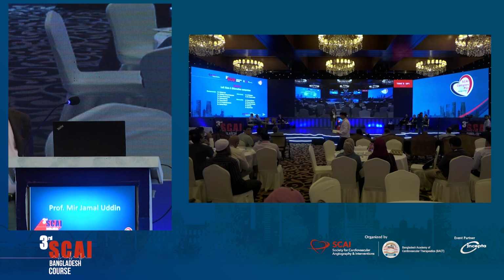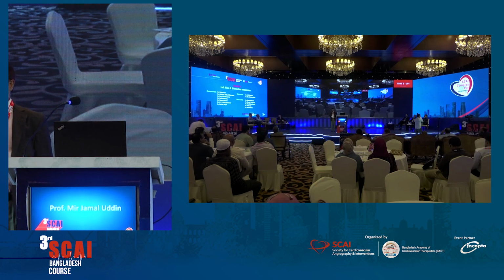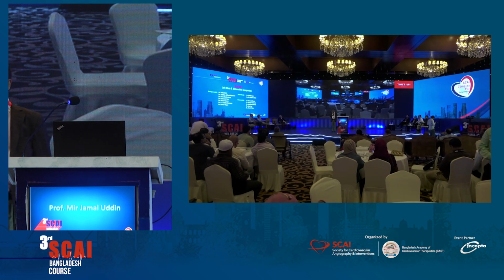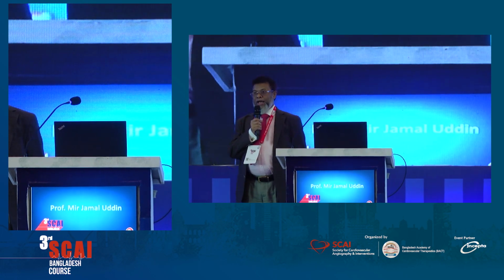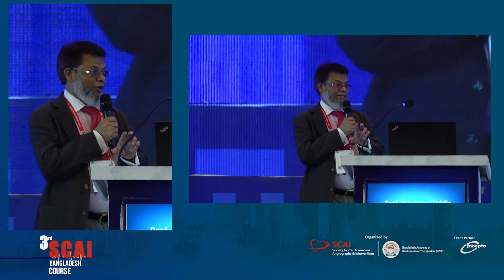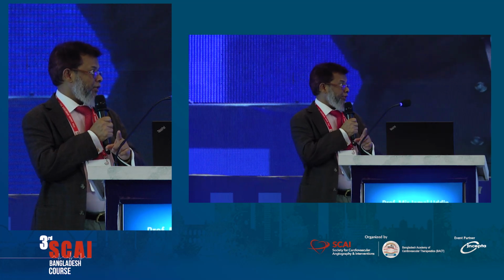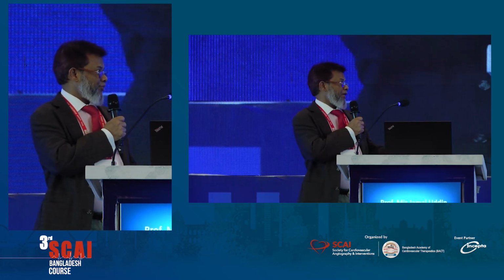That's right. Culotte has been changed nowadays. The first change is mini culotte, then DK mini culotte. Our aim was to do DK mini culotte, but due to the less availability of stent size, the side branch stent is a bit longer. Otherwise, we have done DK culotte only. DK mini has not been done. So, DK mini culotte is almost equal to DK crush, even though DK crush is superior.